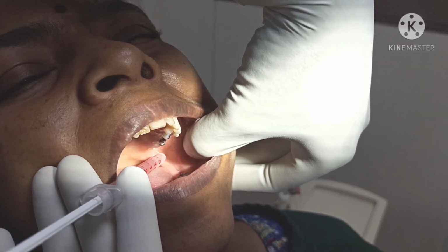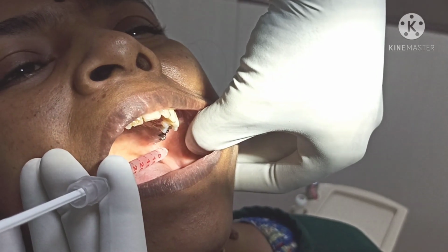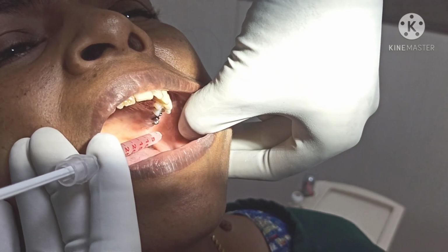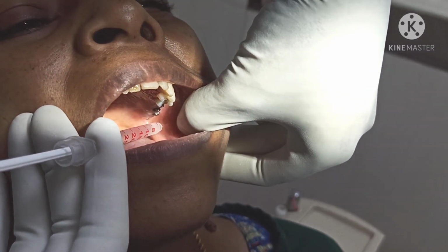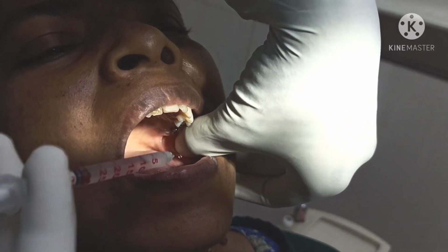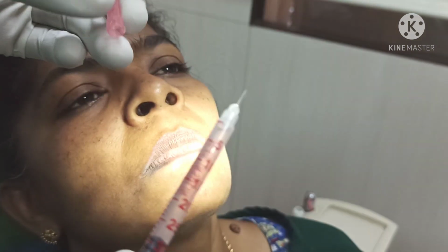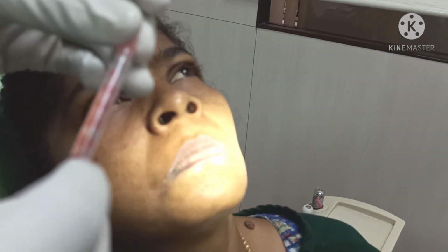I am using an insulin syringe, but not with insulin, but with lignocaine local anesthetic solution. I am slowly injecting a few drops, maybe 0.5 ml is enough. Since this needle is very thin, it is more comfortable to the patient. We are just locally infiltrating the area where we are going to give the block. Just wait for 20 seconds, that is enough, or if you want to wait more, we can wait more.